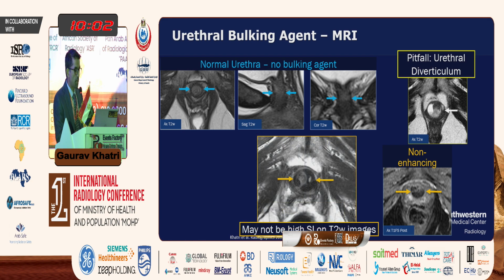And I know I mentioned that oftentimes it's bright on T2 weighted images, but depending on the specific product used, it can calcify and actually be dark on T2 as well.